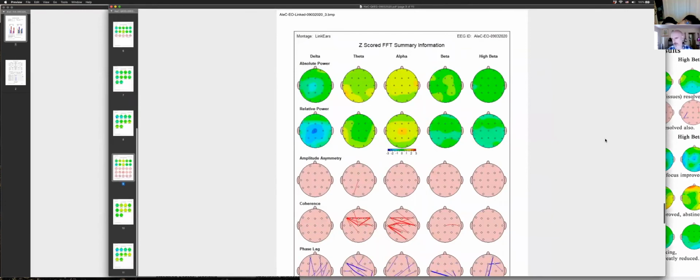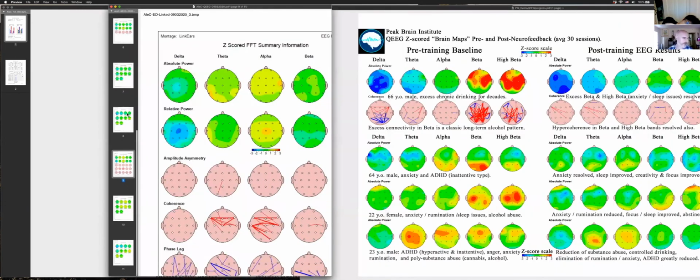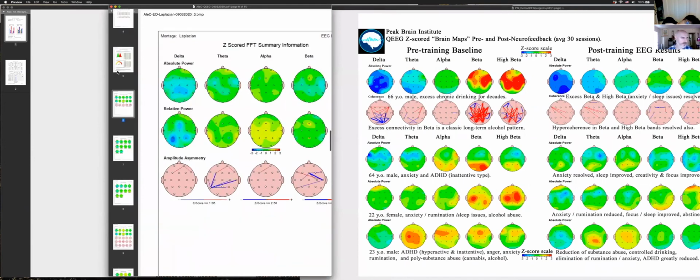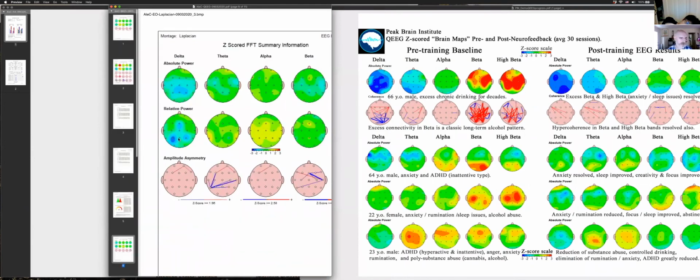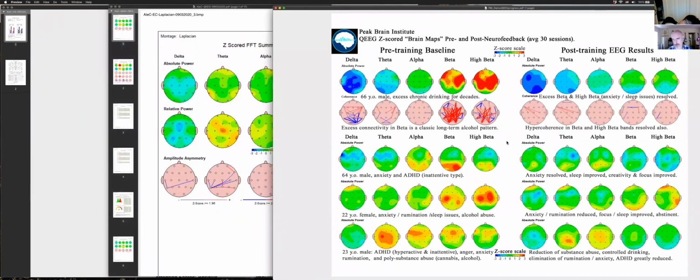I'll find it right there. Not dramatic for you at all, right? Compared to this guy. There's a little bit right there, you know. And that's just a sign you can't make good deep sleep. But for him, it was a function of drinking, and he just didn't sleep very well for decades. Well, these are all the same people on the right-hand side after doing 10 weeks of neurofeedback. They had dramatic subjective experience changes across this kind of time. Oh, wow.